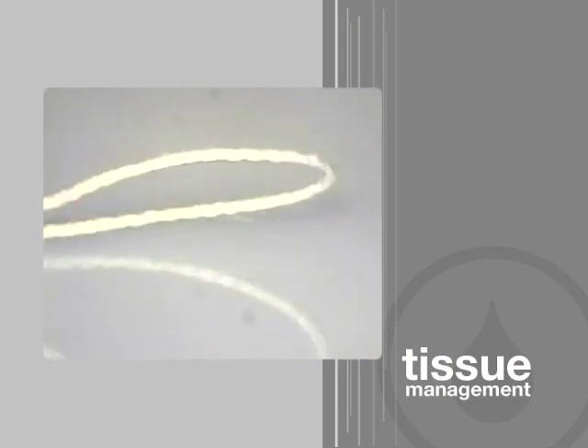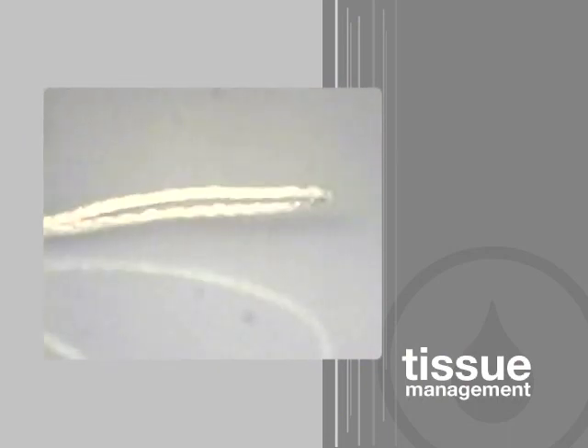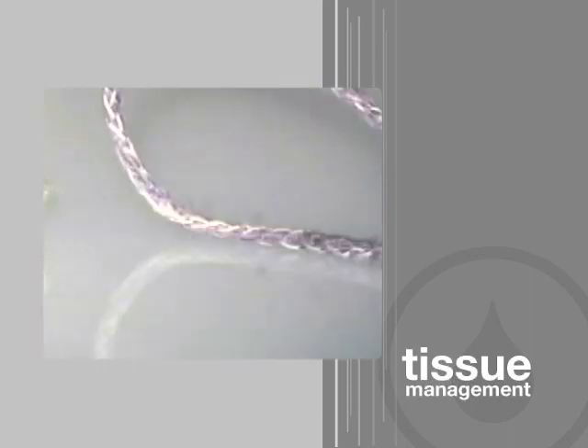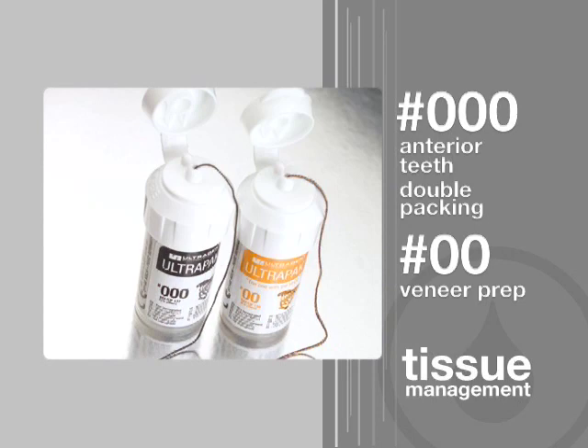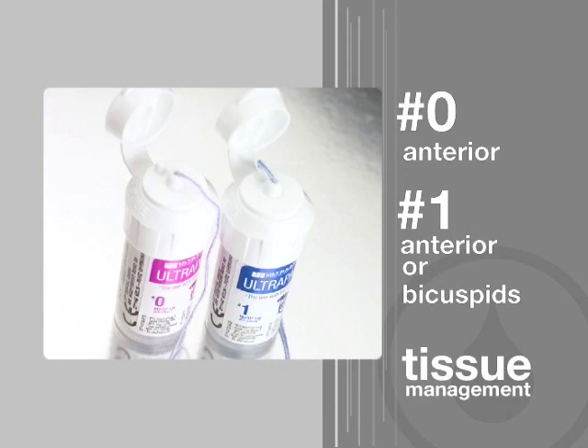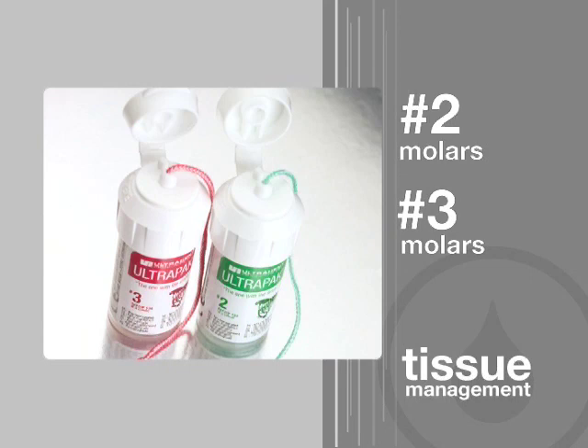Watch what happens when an ordinary braided cord is pushed down — it springs back up and returns to its original shape. But when the Ultra-Pak cord is pressed down, it stays. Ultra-Pak cords come in six convenient sizes. The cord size selected should be large enough to compensate for the compression of packing. However, tissue firmness and friability, as well as the amount of space desired, may require using different sizes.